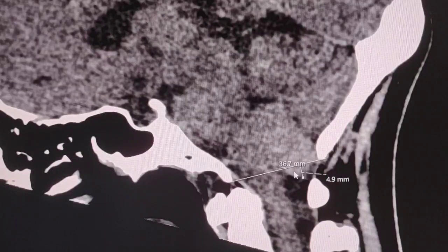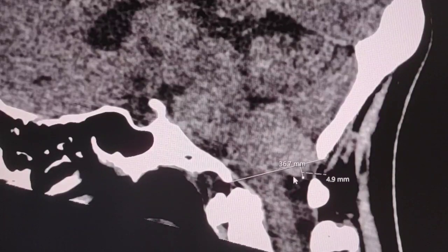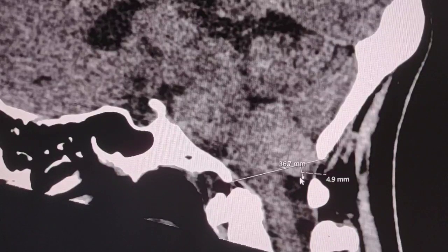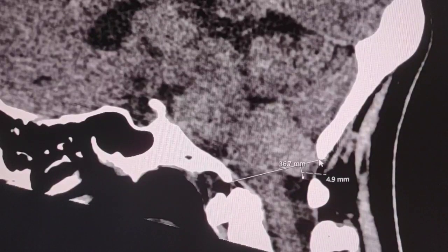The conclusion here is that radiologists must be aware of this condition and must always report if there is any projection of the cerebellar tonsils beyond 5 mm from the lower aspect of the foramen magnum.